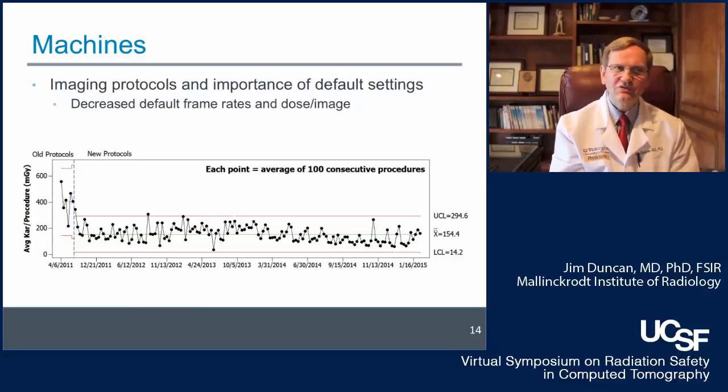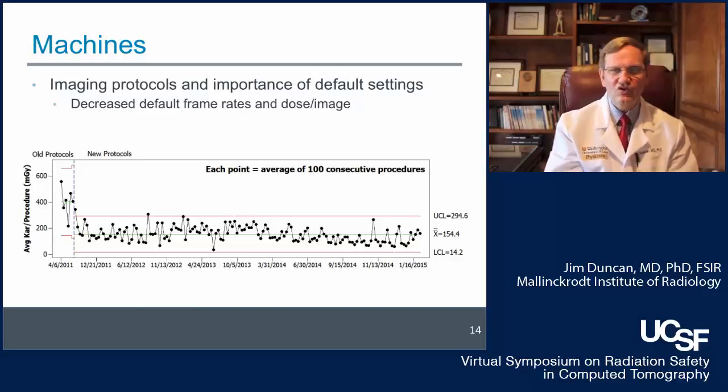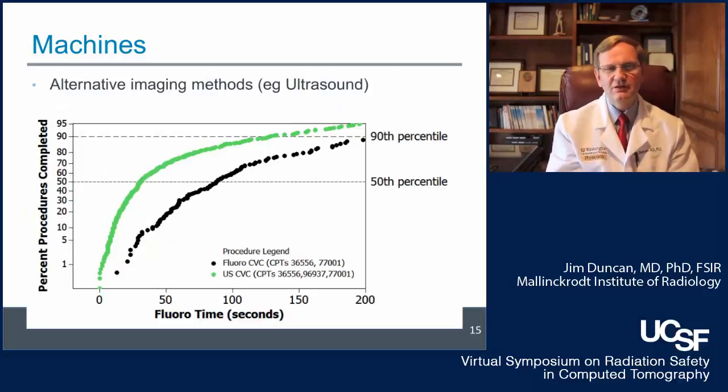And it really came to what drove it was we found that when we started at medium, it was relatively rare for someone to recognize halfway during the procedure that the images were better than they needed and drop it. It's much easier to say these images aren't quite what I need for the procedure and move from low to the medium setting.